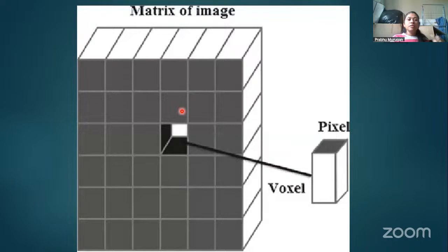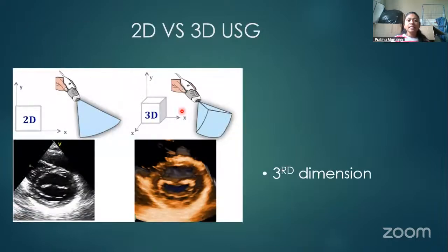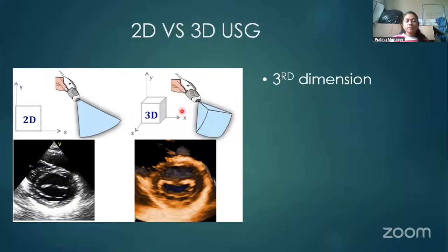Okay. So 2D to 3D conversion, there we saw it as pixels. Here it becomes voxels. Pixels mean picture elements. Voxels are nothing but volumetric elements. So 3D basically is going to include the most important ones, that is your CT, CBCT, and MRI and all that. We'll stop the class with this small concept alone.